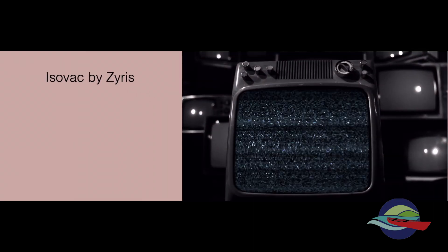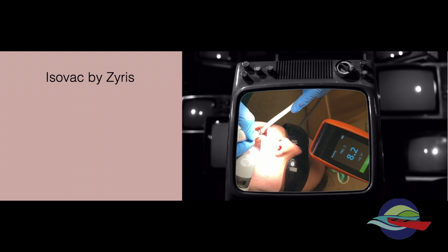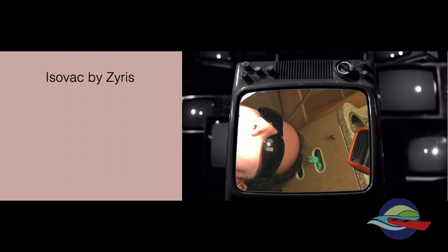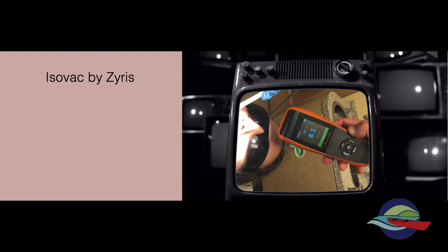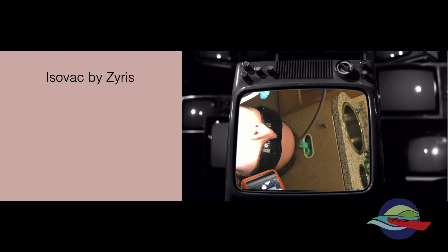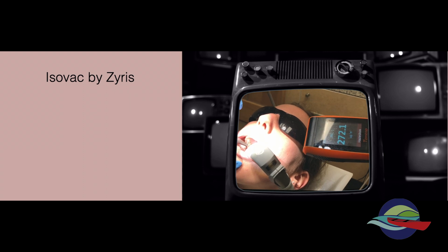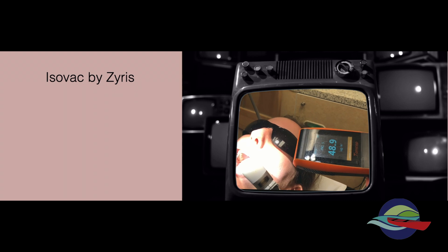Next, we used the IsoVac, and this proved a bit more challenging in controlling the aerosols. Especially in the anterior area, it was really difficult to control aerosols, as you can see by the high numbers being generated here. I can certainly see the advantage of this unit for doing restorative dentistry in a specific area, but it's a bit cumbersome if you want to do the entire mouth. Here we're almost at 300, but it was also the first time that we worked with this unit.